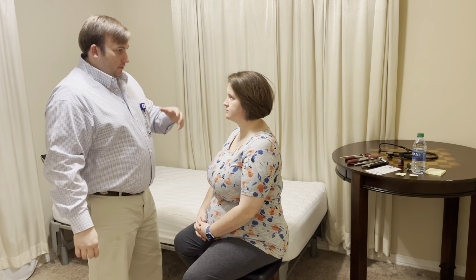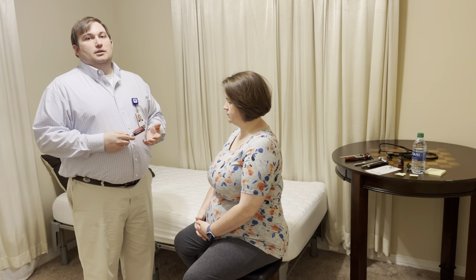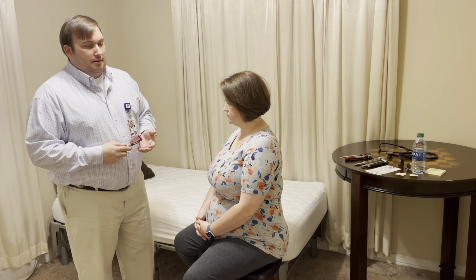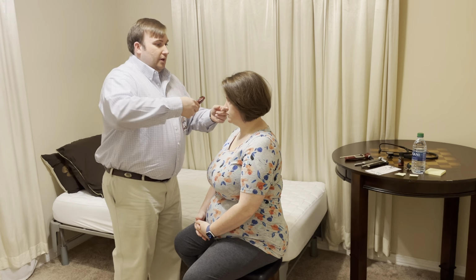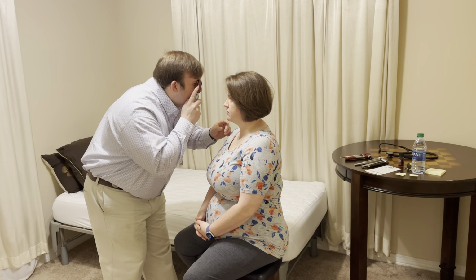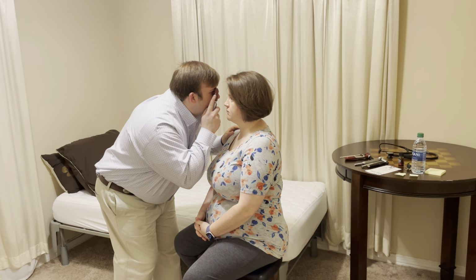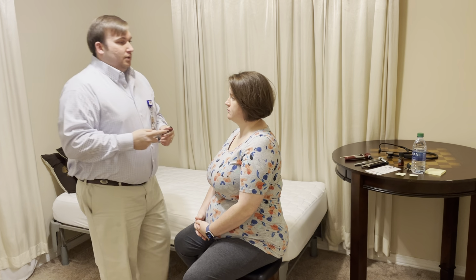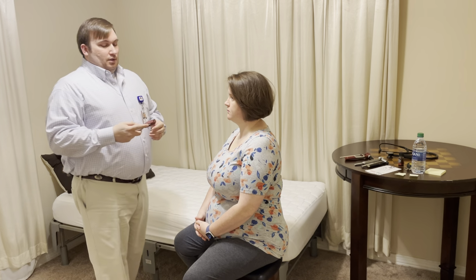Okay, I'm going to go ahead and assess with the ophthalmoscope. What I'm going to be looking for here is the fundus, the macula. I'll be looking at the veins in her eyes. I'll be looking for the red light reflex and the optic disc. All right, if you'll just look straight ahead. Okay. No hemorrhaging or narrowing of the veins noted. Optic disc was present, and the red light reflex was present as well.